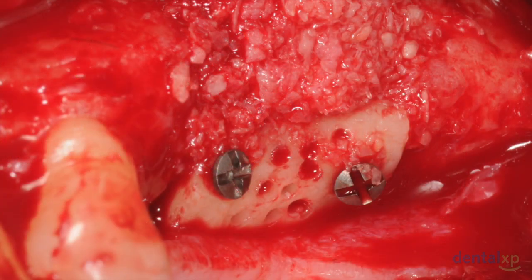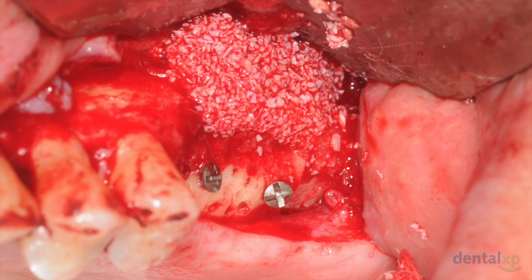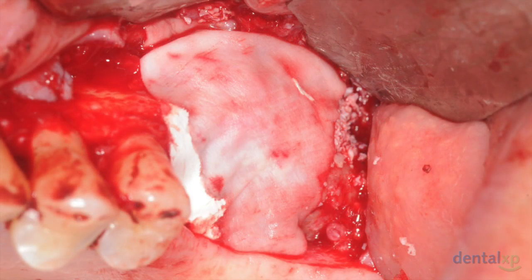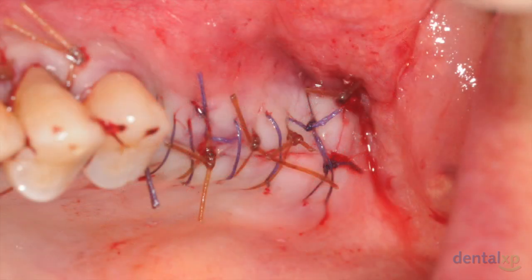We'll then place the particulate graft in the sinus and between the block shell and the ridge. And finally, layer some Bio-Oss superficially, which has less resorption and hence helps to preserve the buccal form. A resorbable membrane is then placed over the sinus and the ridge graft, and then we'll proceed with the flap repositioning and closure. Multiple horizontal mattress sutures and running sutures help to approximate the tissue.